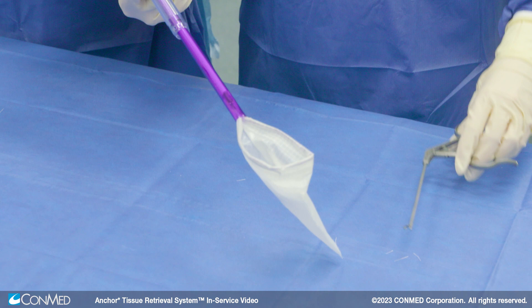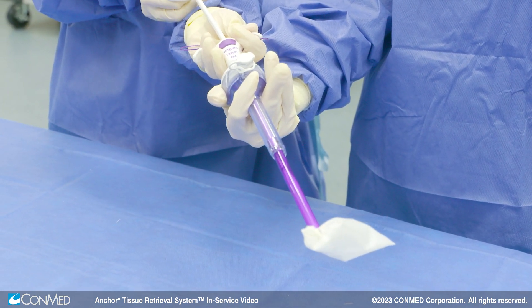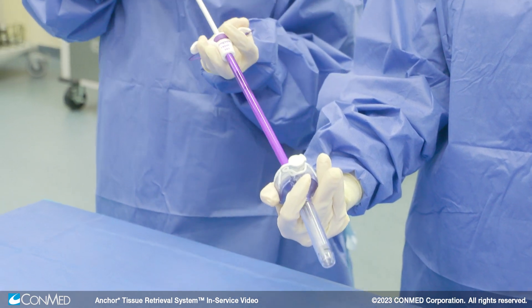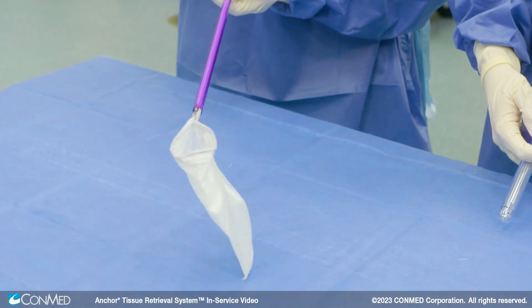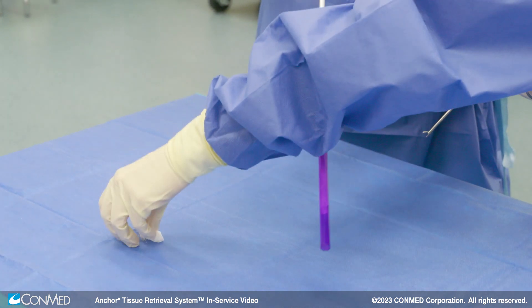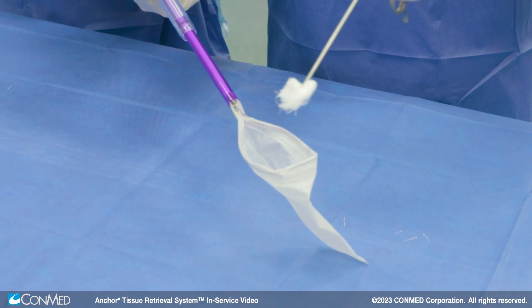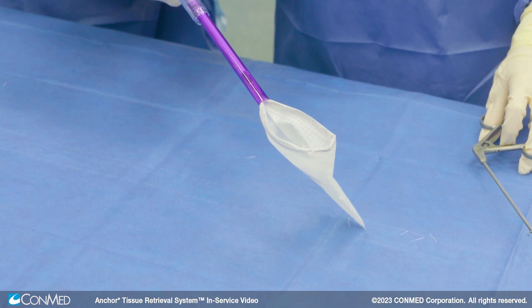If redeployment is necessary to retrieve multiple specimens, retract the plunger to cinch the bag against the introducer. Once the bag has been cinched, remove the Anker Tissue Retrieval System and specimen. Once outside the body, push the plunger in to redeploy the bag and remove the specimen. The Anker bag can be redeployed during the same case by pulling back on the handle and repeating the deployment steps to retrieve additional specimens as needed.